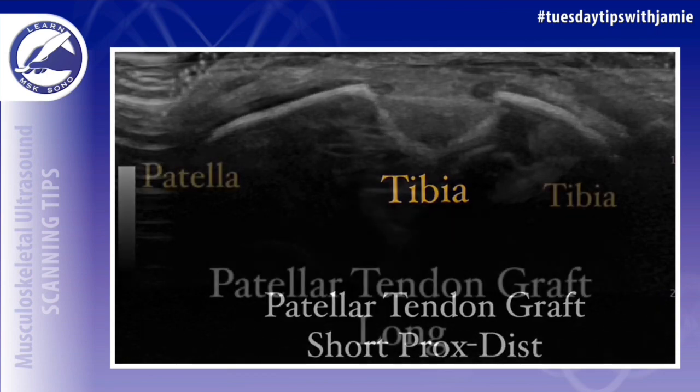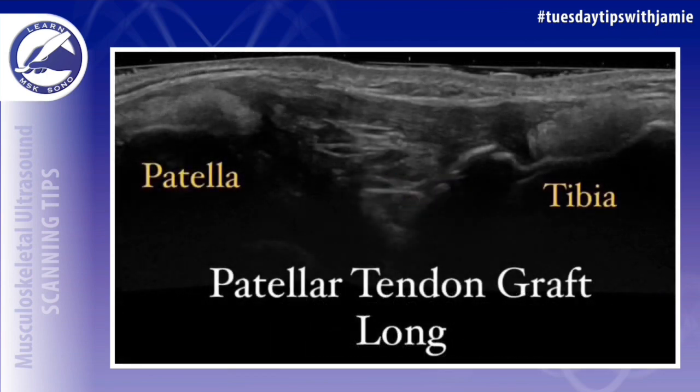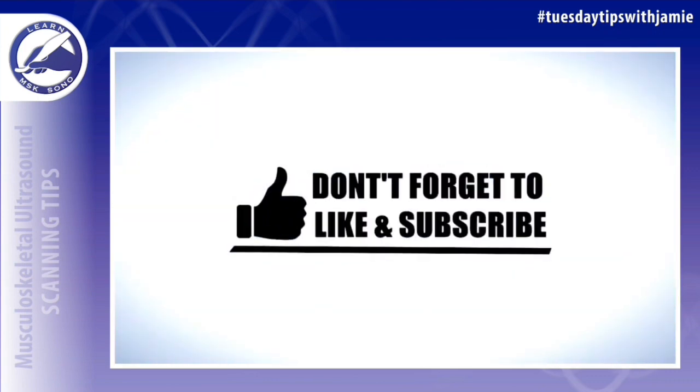The new graft includes this strip of tendon along with attached plugs of bone from the distal patella and from the proximal tibia. This is why it's referred to as a bone-to-patellar tendon-to-bone graft. When the surgeon implants the new graft, the bony plugs on each end of the graft fit inside a tunnel of bone. The body responds by healing the two surfaces together.